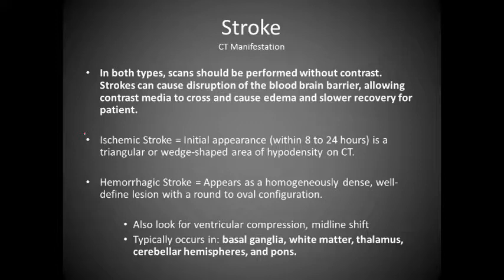I've had probably 3 incidences in my career where I have been scanning a patient and the exam has been ordered with and without contrast, and I see something that looks like a hemorrhage and I have to send it out. One time it was a mass that was causing a hemorrhagic effect in the brain, and the radiologist said that I could go ahead and inject the contrast.